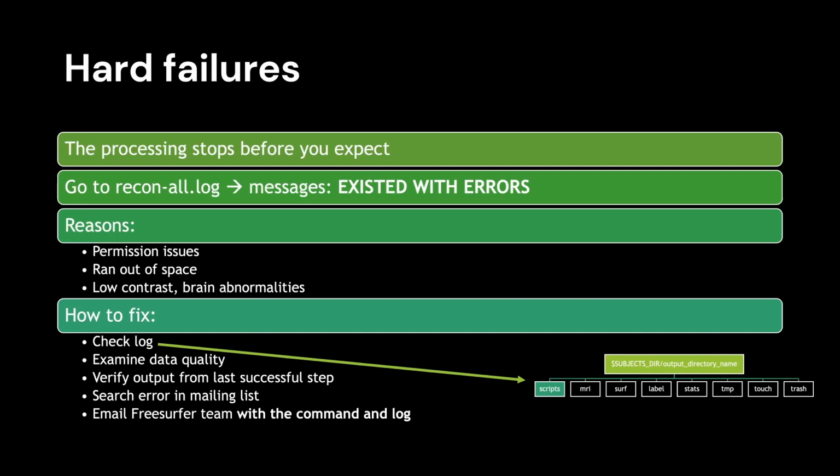How to fix this? First of all, go to your log and read what happened and what was the last step to understand what could have gone wrong. Second, open the last image or the last file that it created to check the data quality, and also check the data quality of your input image. Verify again the output of the last successful step. And if you still do not understand the error, you can email the FreeSurfer team, but please make sure you send them the log, this log here, and the command that you used.